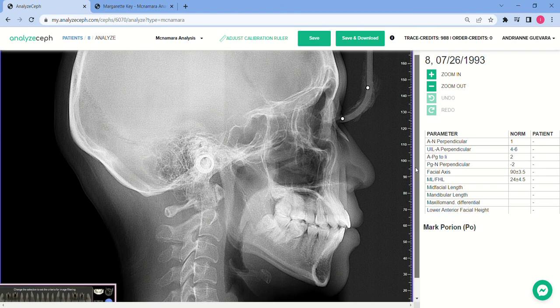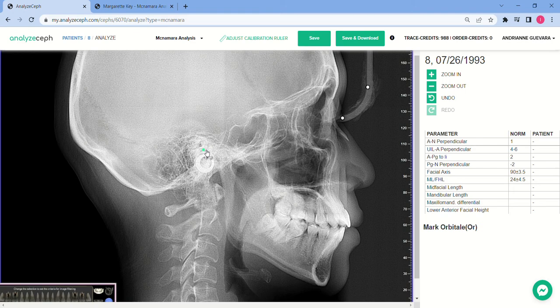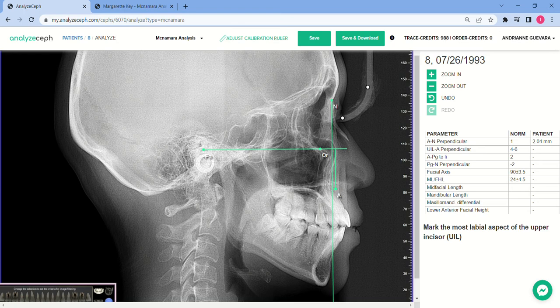It says here: mark porion. So we're marking the anatomical porion. Mark orbitale. Mark nasion. Mark point A. Mark the most labial aspect of the upper incisor. Mark pogonion.